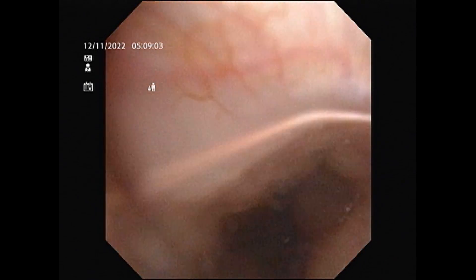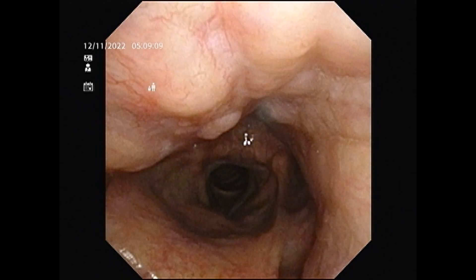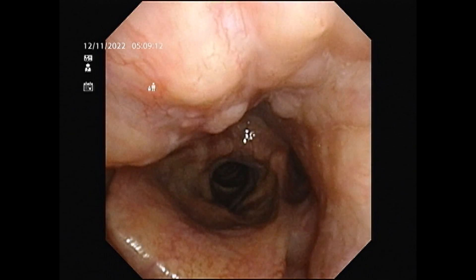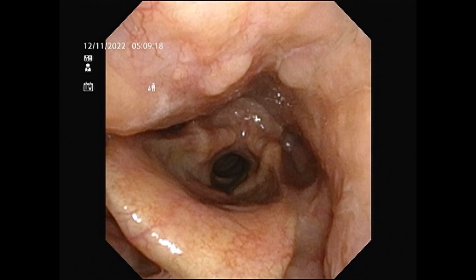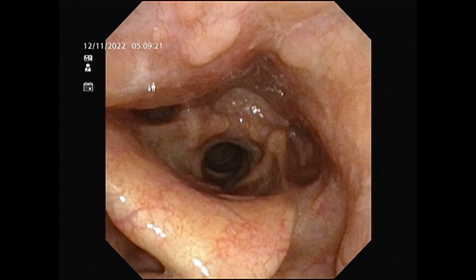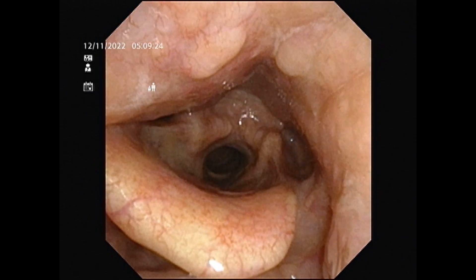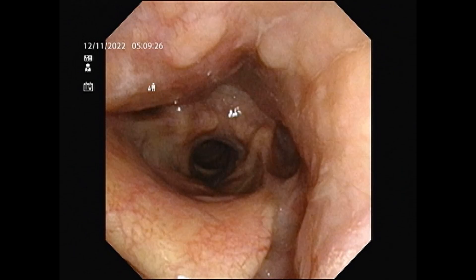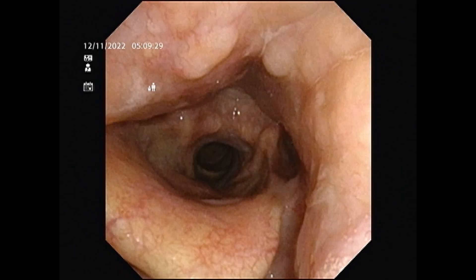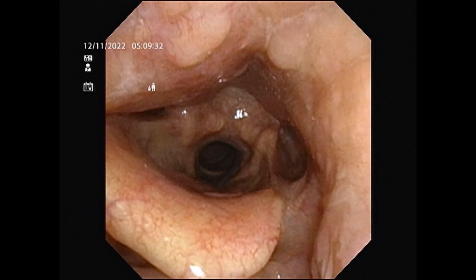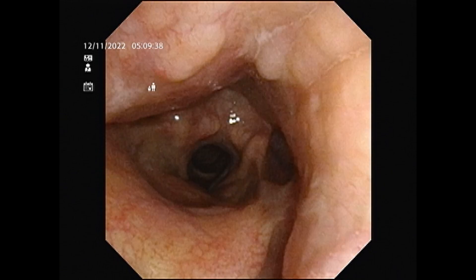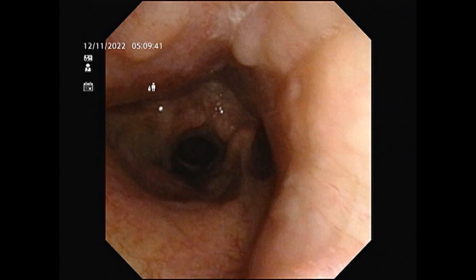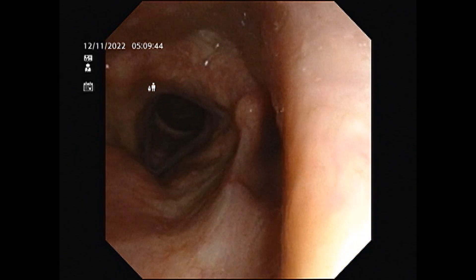I am trying to pass my endoscope further down beyond. You can see a structure called the epiglottis at the 6, 7 and 8 o'clock position — a leaf-like structure. Beyond that, you can see a V-shaped structure trying to open up and close — these are the patient's vocal cords. And you can see a tunnel going beyond: that is the patient's windpipe which reaches up to the lungs. This is a normal pattern of breathing where everything remains open so we can freely breathe without any snoring.